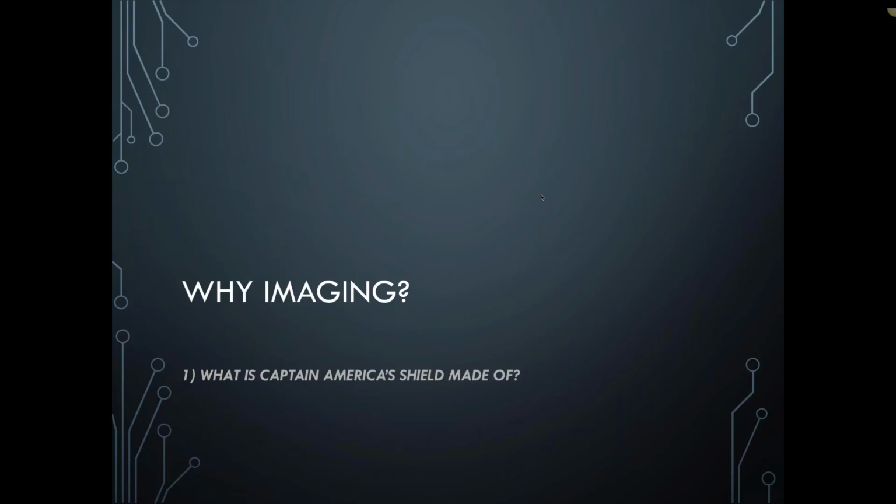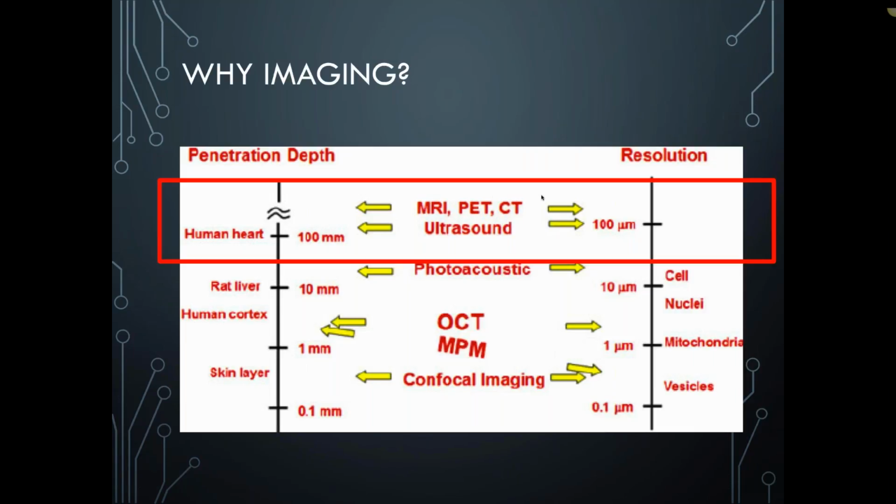Okay, so why imaging is important to begin with, and why we might want to consider building imaging informatics tools to support it. There's, of course, lots of different kinds of imaging that cover a very broad spectrum, many orders of magnitude of scale, and that have very different kinds of preparations and apparatus to acquire the images. What we're going to be talking about today is primarily imaging at the millimeter and submillimeter scale, and includes many of the common medical imaging modalities.